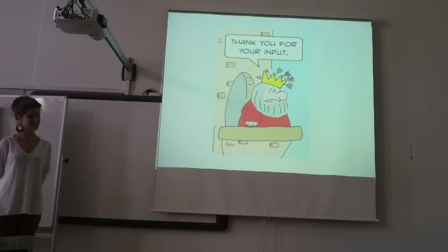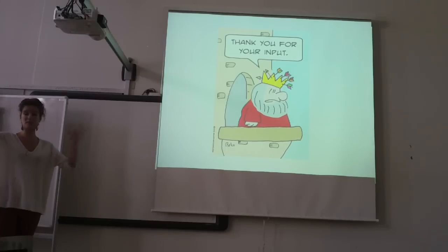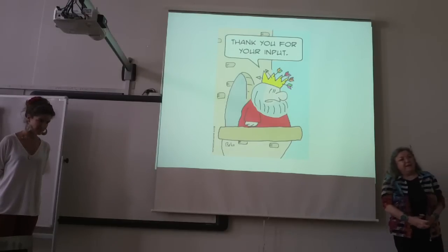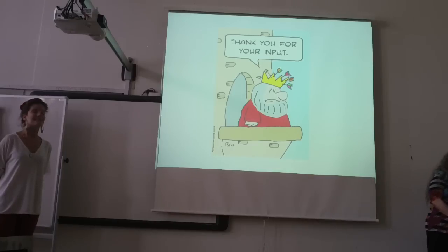I'm interested in when you studied, looked at the flageolet, how loud did you take it? From very silent to very loud. Okay. So there was freewheel all over the place. So all volumes. And was it at any point so that the flageolet could be confused with neutral? Were you ever in doubt?